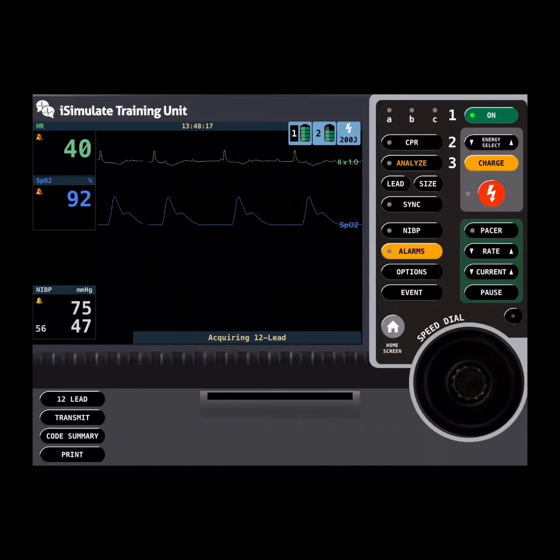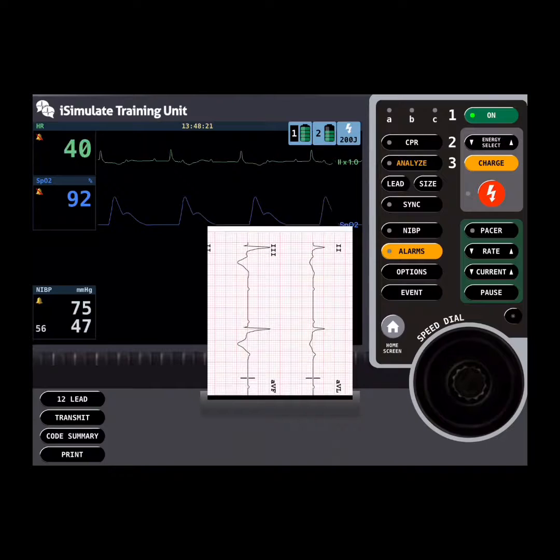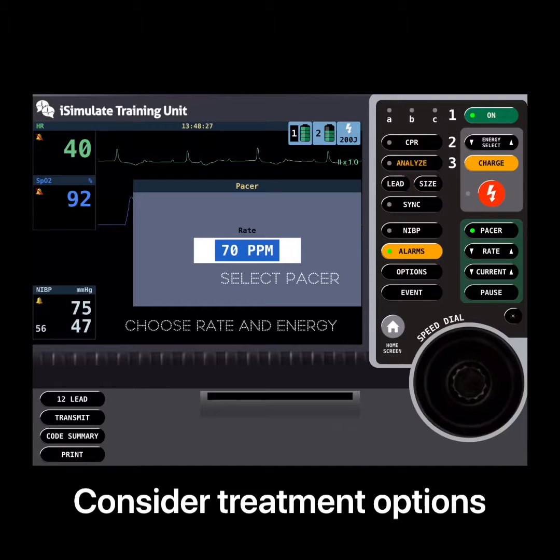Watching the patient themselves, they decided to push 12-lead again just to confirm what was seen before. They printed off another one and then had a discussion about treatment options, and they opted quite quickly to go to the pacer. Defib pads were there and available, so pacing was chosen.